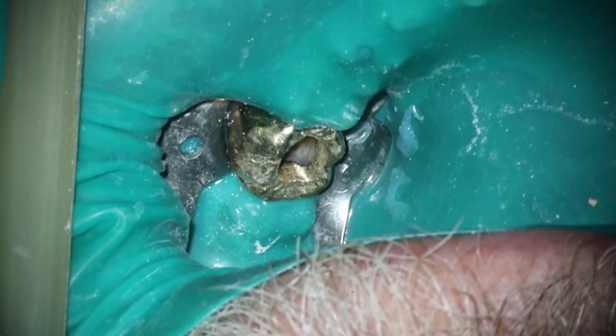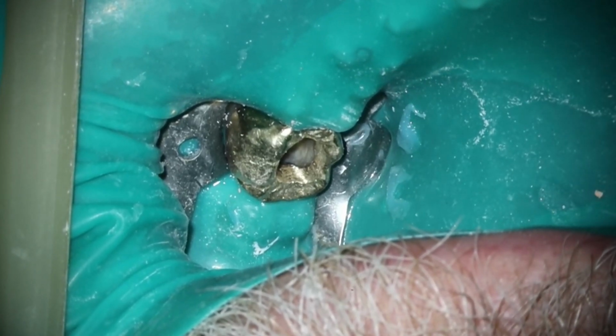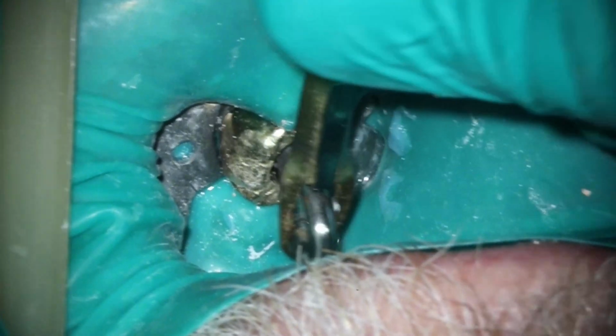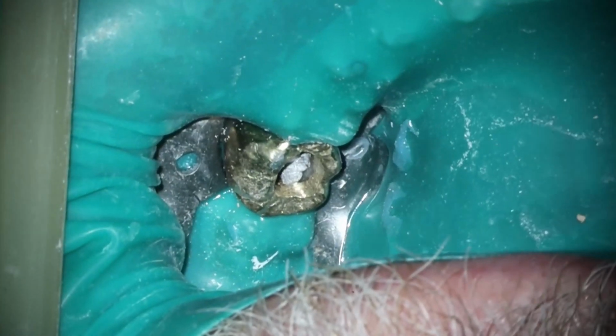I'm working with my youngest assistant right here. So this is why there's a little bit more of a delay, which is, it's taking her time to get used to packing amalgam and knowing the instruments and things like that. She's doing great. But if anyone out there is a more seasoned dentist or a military dentist, and you have tips and tricks for teaching assistants on amalgam, I'd love to hear it.